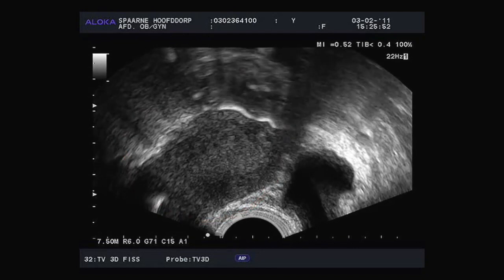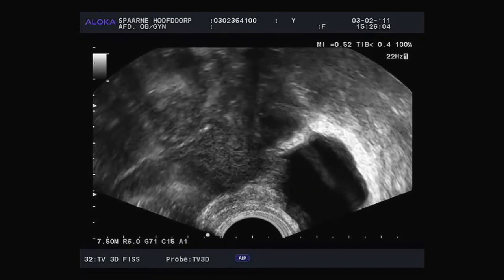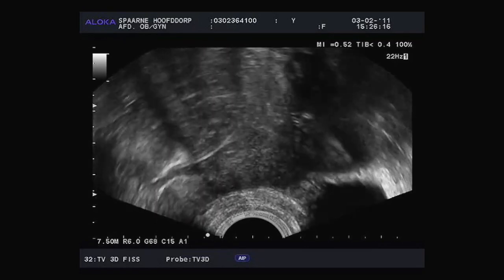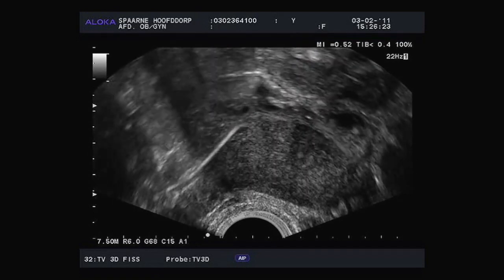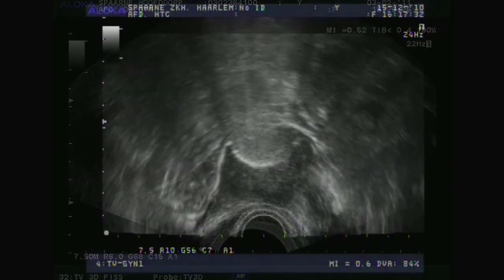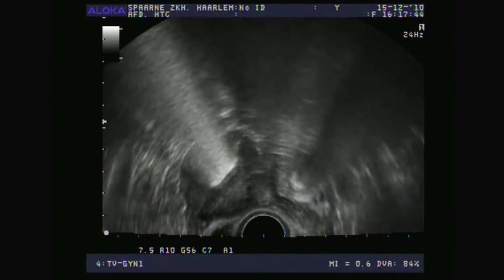Here is another thin, nice white line — a healthy fallopian tube. At the end of the film it becomes immediately and completely clear. I'll try to make this one as long as possible, turning with the tip of the ultrasound. Here you see that nice thin continuous white line. Now, if I freeze the image, you can see a beautiful fallopian tube, and if you look closely, you can even see the tube of foam bubbles. This funny white line is the foam. You cannot see the ovary so well on this side, but you can see the foam coming through very clearly. This is the ovary and this is the foam next to it. This is how you know that the fallopian tube is open.